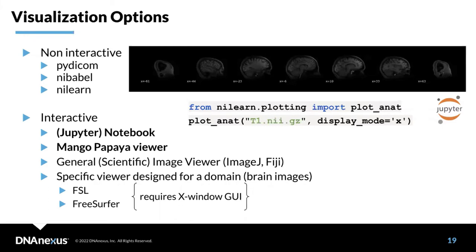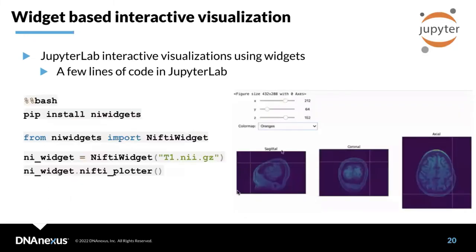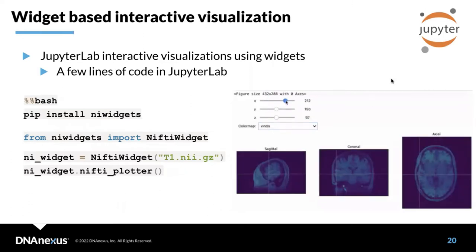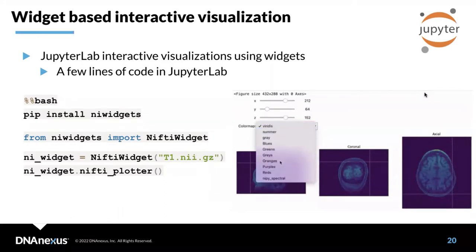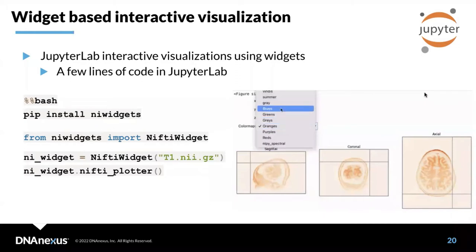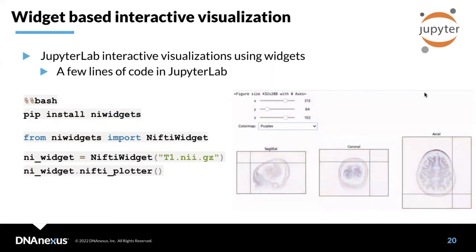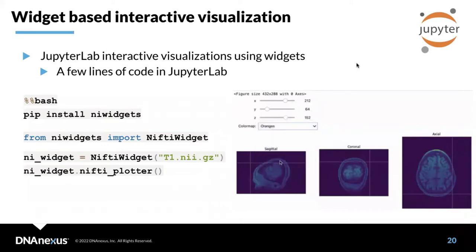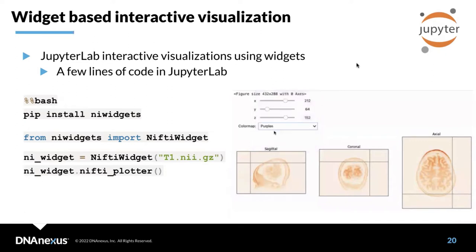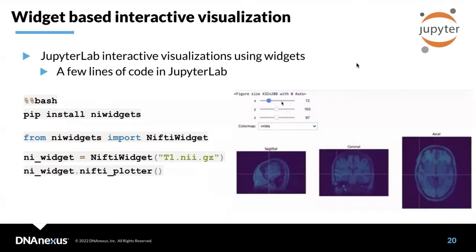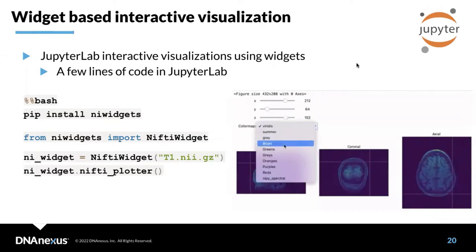One example of interactive visualization is a widget-based solution you can implement in JupyterLab with just a few lines of code — importing a NIfTI widget library and visualizing the data. On the right side of the screen you can see the actual visualization, controllable via sliders. You can also change the color of individual axes — sagittal view, coronal view, and axial view — making it a useful method for quality control of imaging data.